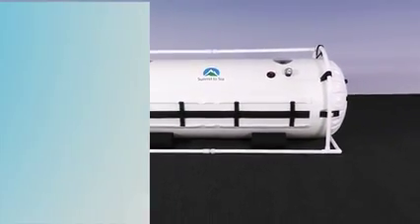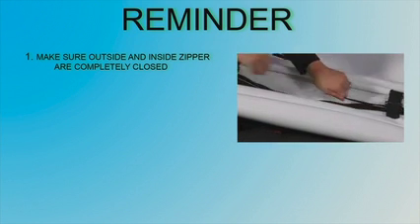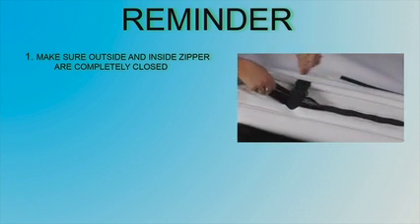We hope that this short video has been helpful for you to become more familiar and comfortable when operating your chamber. It is very important to heed these few important reminders. Remember, make sure all buckles are closed and both the inside and outside zippers are completely closed every time the chamber is in use. Failure to do this may result in an inability to pressurize or damage the chamber.